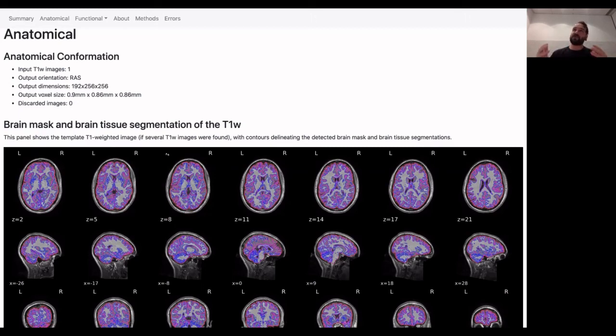First of all, that kind of manual intervention introduces all sorts of errors and allows you to weirdly fine tune your analysis pipeline in ways that maybe you shouldn't. fMRIPrep does that automatically based on these community driven standards and heuristics. And fMRIPrep is what we call a glass box, right? fMRIPrep has exceptionally detailed documentation. All of the code, you can introspect any of the code, all of the errors are tracked. And basically at every stage of the analysis, you can see what the inputs and outputs were. You can see the graph structure of the workflow, and you get all of these beautiful visualizations of what's going on at each stage here.